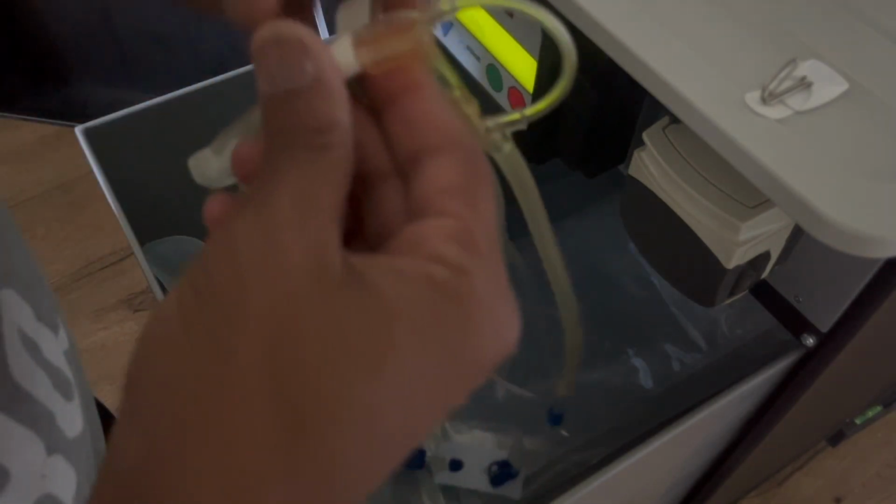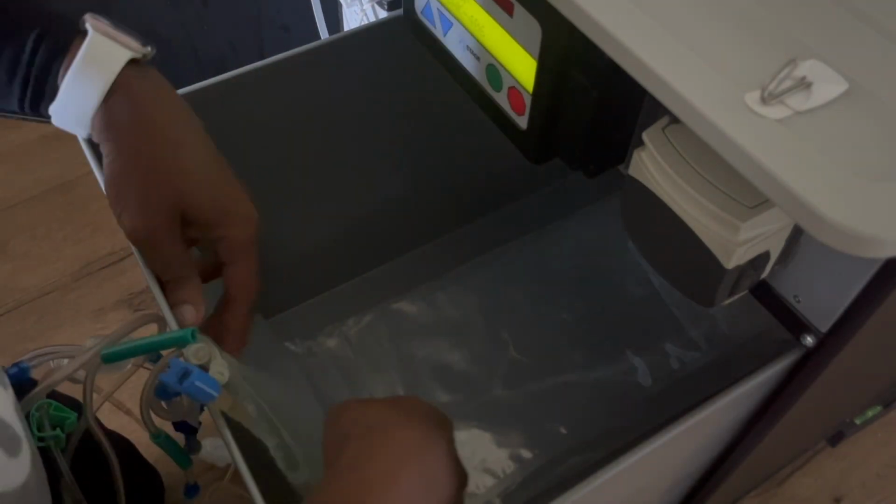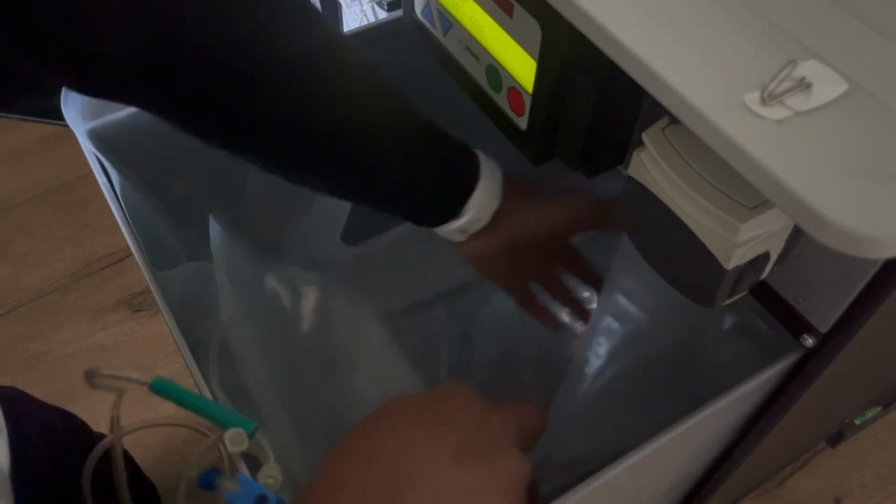And then you're going to set the tubes to the side. Open up the plastic bag. Spread it out evenly throughout the tub.